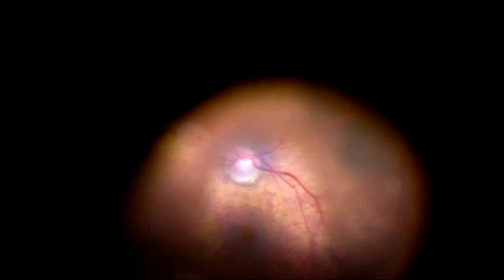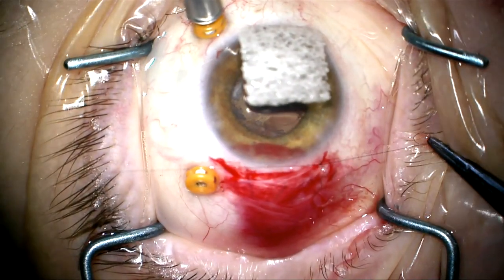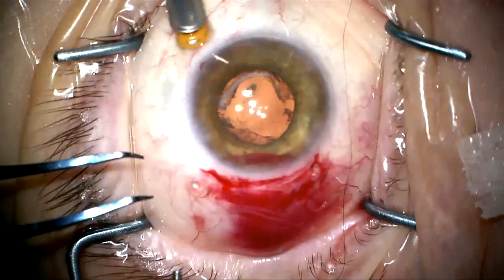We're now going to make sure that none of the segments or pieces of Soemmering's ring have fallen back. We're going to do a complete vitrectomy. There are some little bits of fragments and opacified vitreous here to clean up. We'll inspect the area of the vitreous base and remove the peripheral vitreous as well for a thorough complete vitrectomy. As I do this you can see the edge of the trocar come into view. The vitrectomy is completed and the lens is very stable.